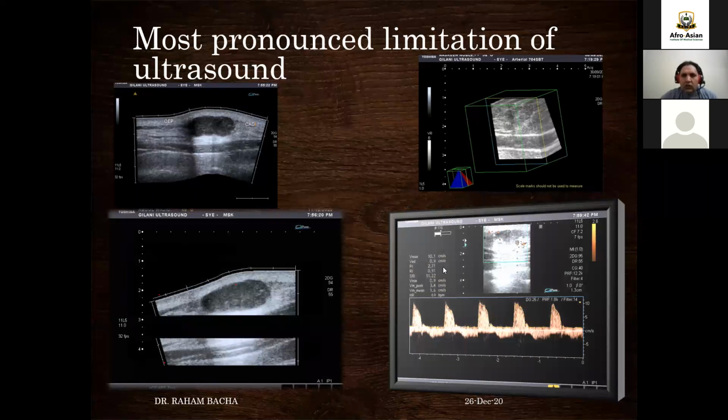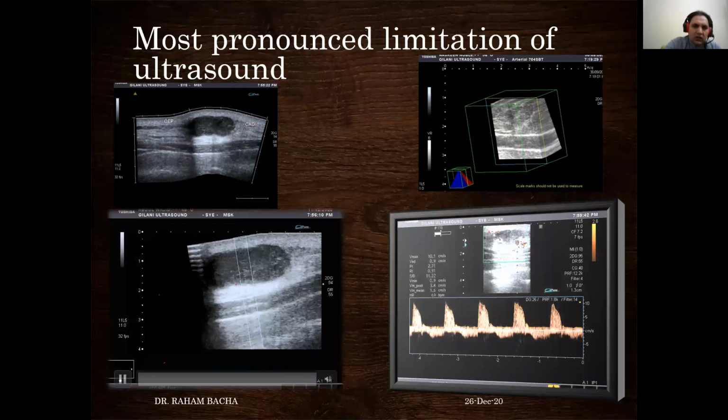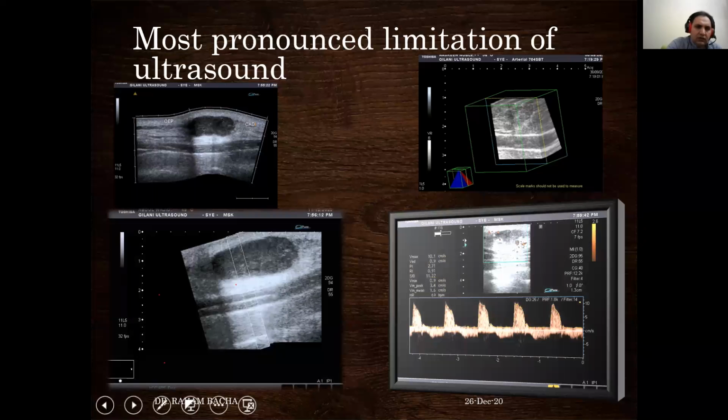Okay. So in this slide, we have tried to make a panoramic view image of the same structure. And here, a three-dimensional image is also made.